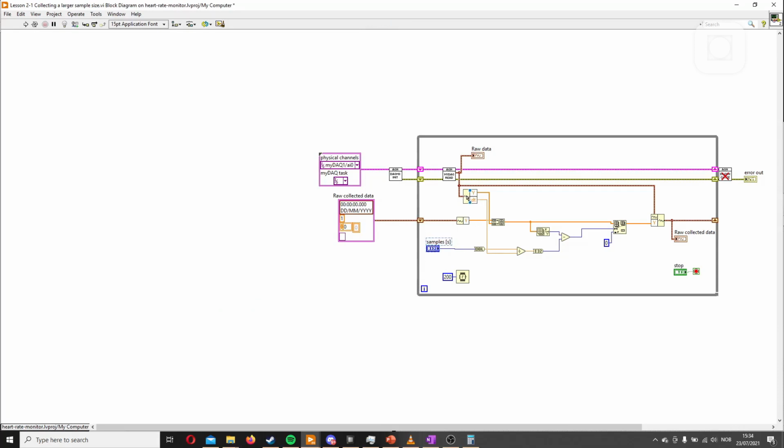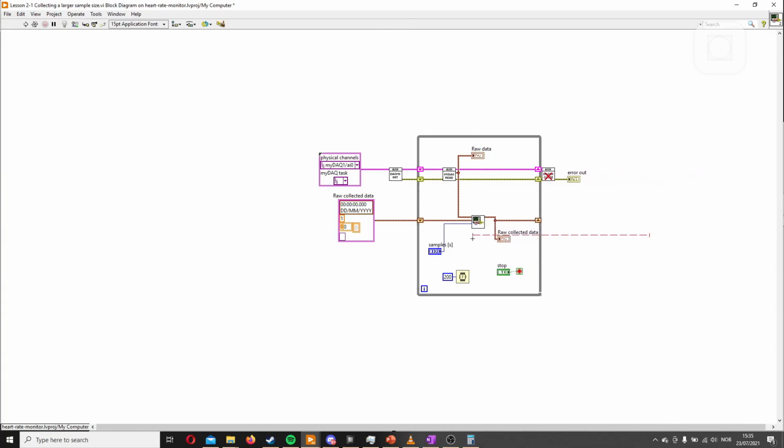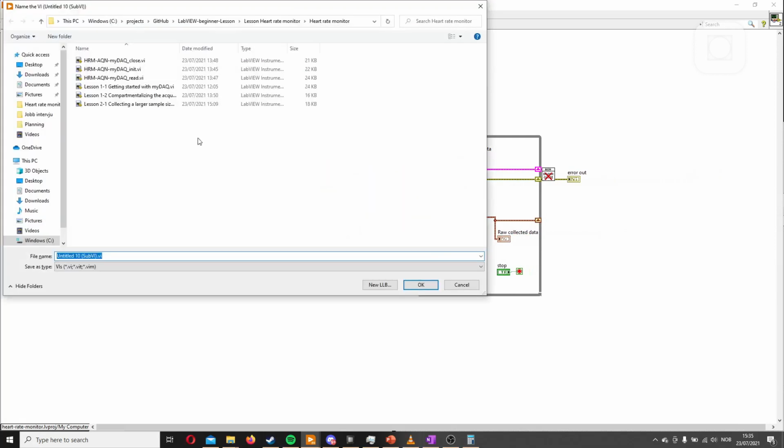We want this to be an input, and we want this to be the output, and we also want this to be an input. So what we'll do is we'll cover everything, we'll gather it a little bit, pull it down, and cover everything we want inside of the sub-VI. And this is it. And we'll do the same thing, create a sub-VI, and here we have it. We can place it there, take this one a little bit closer, then open it. We'll save it, and we'll call it the acquisition and set waveform size.